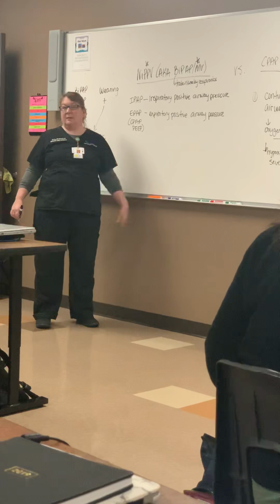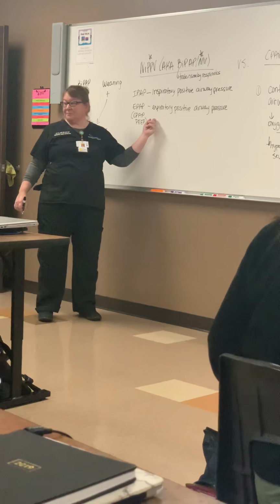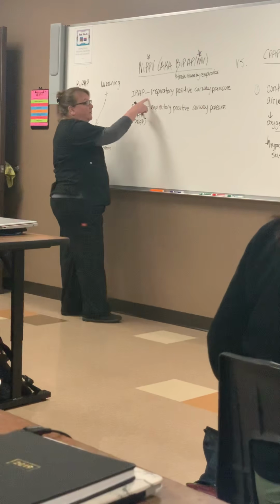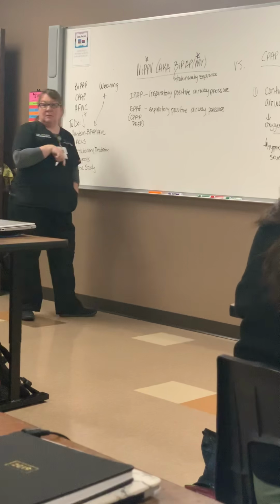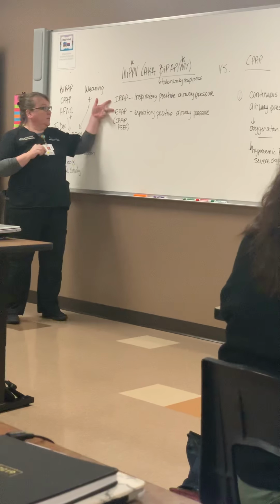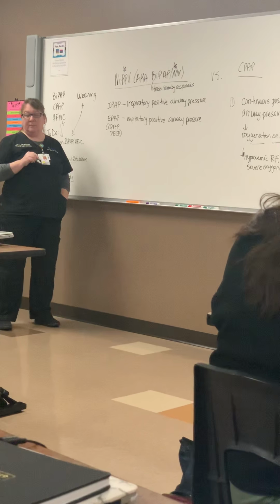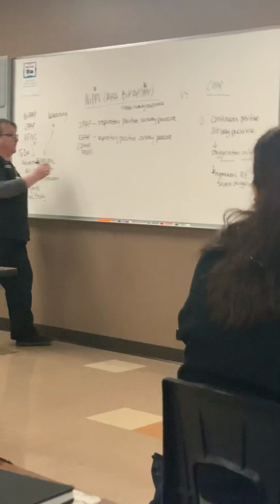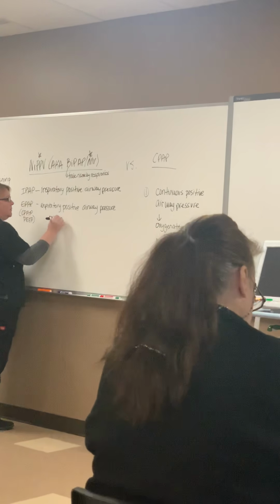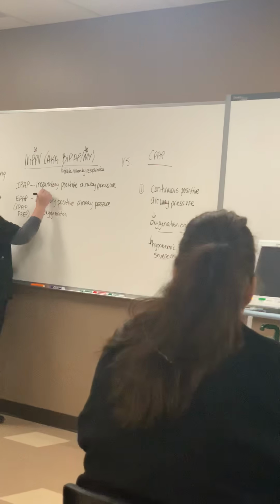We see nasal cannulas, high flow nasal cannulas, and this guy. So of these two settings, between IPAP and EPAP, which one on a BiPAP is for oxygenation? EPAP. Yes. So EPAP is oxygenation, and IPAP is for ventilation.